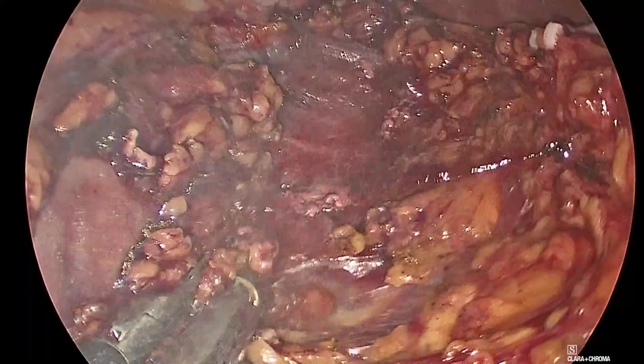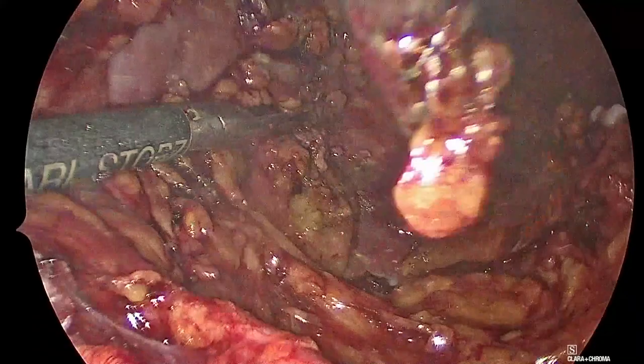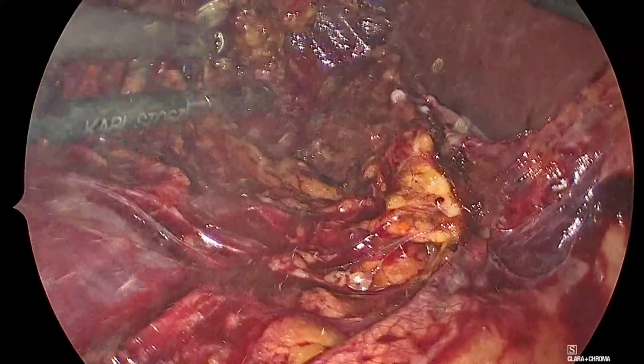Acuérdate que estás totalmente girado, Luis. Okay, vamos atrás. All right, so we're getting close to the end, meaning that we have here to find nice the artery, which I think we know where it is, but we want to see it better. Come closer.